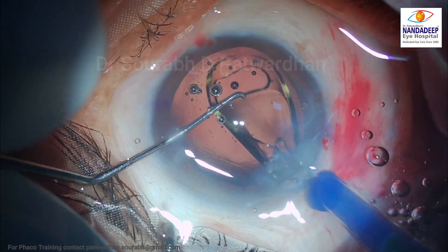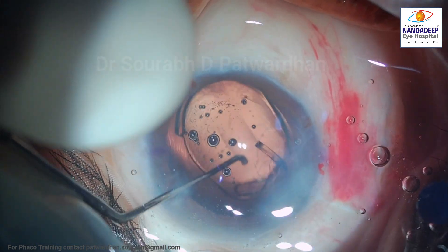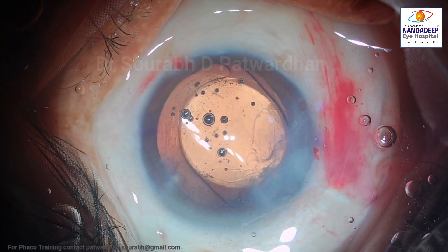This is a foldable IOL, so I am going to put it in the bag. Let the haptic get unfolded — it should go into the equator of the bag.